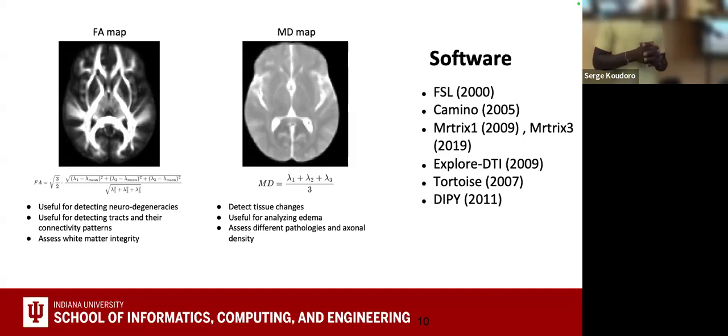But DiPy arrived out of a frustration that back then these tools were very closed source and they were mono-lab. Every tool was coming from one unique lab. When you were doing research in a different environment, it was hard first to compare the different methods. When you were running DTI in one tool and DTI in another tool, you had small, tiny differences and you couldn't understand why. Trying to get the source code to understand was impossible. Trying to reach the lab was very complicated. So this mindset started to bother a big community, and this is why DiPy got created.